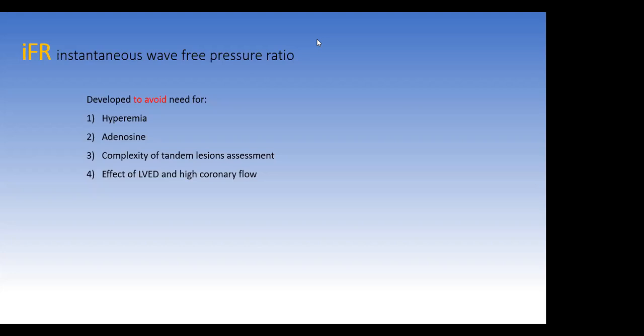Other barriers: penetration everywhere in the world is about 10% for all cases being done, with the exception, I believe, of South Korea, which has close to 100% use for all patients, but the price for them is significantly lower. Just to put it in perspective, using FFR, OCT, or IVUS is $1,000 extra for every single patient. With 4,000 cases, you can imagine what the price would be.